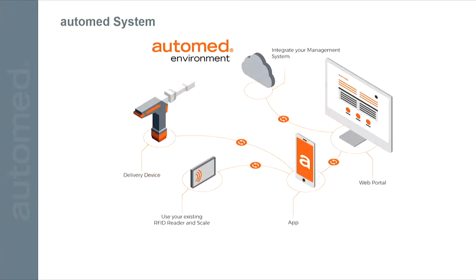This is the Automed system, and this is the heart of it. It's an automatic device to medicate an animal. You pull the trigger and it puts whatever the medication is into the animal, either injecting it or drenching it. It also reads the ear tag, and that is recorded. I just forgot the important bit.